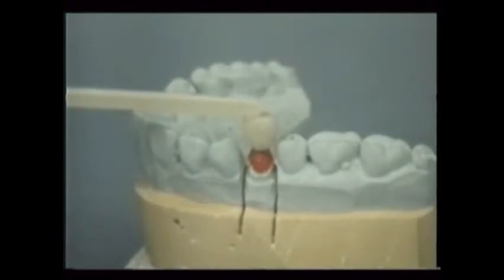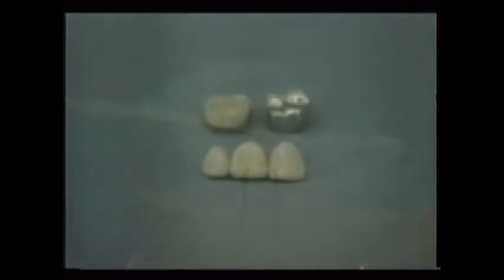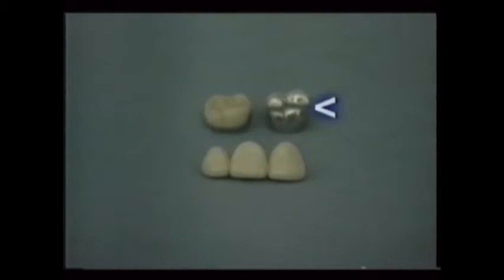Indirectly placed restorations include crowns and onlays, which offer full coverage for extremely weakened teeth, and smaller inlays, which are cemented or bonded within a tooth, much like Class II fillings, but with much greater longevity. Full crowns may be made out of gold, which is the most durable and state-of-the-art material, or of a non-precious and cheaper metal. Most front crowns are fabricated using all porcelain, or porcelain fused to a metal base.